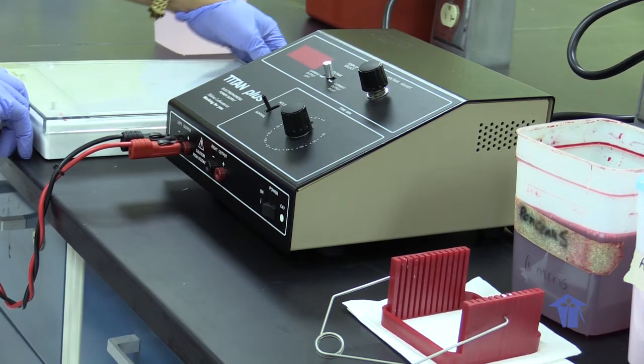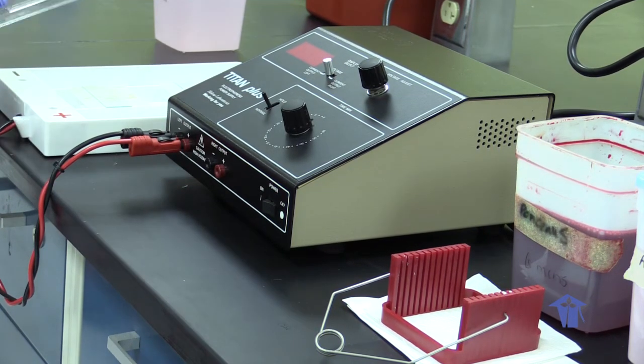So we're going to remove the slides from the chamber.